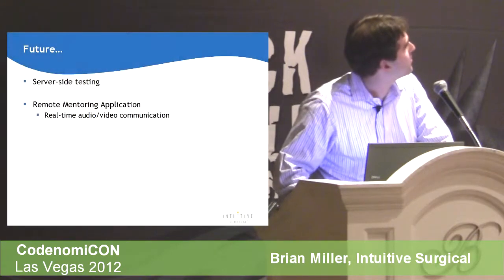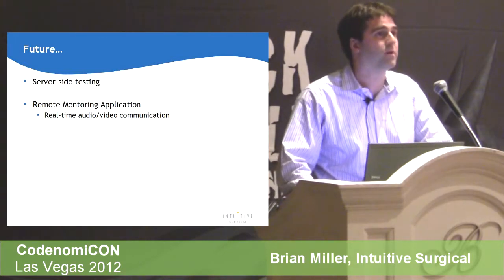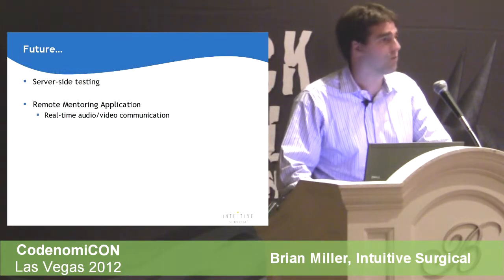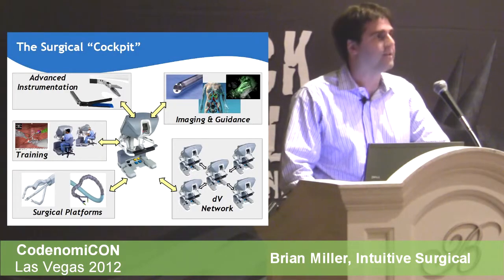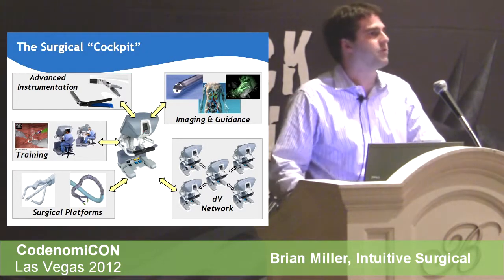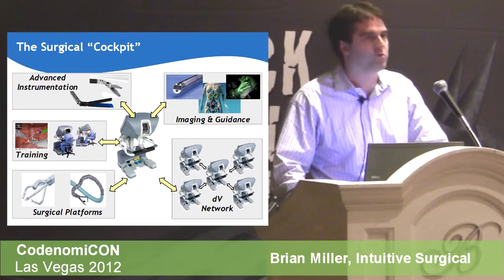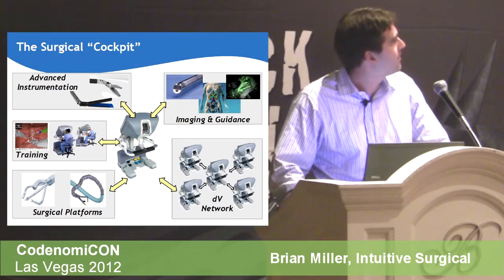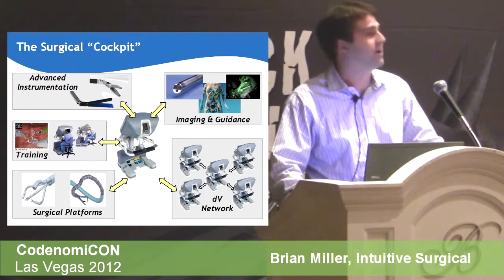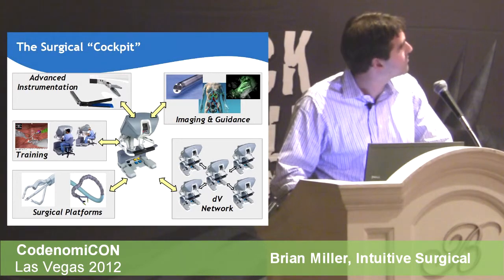As we look into the future of what we'll be doing from the robotic standpoint to help surgical techniques out there, the one that's most relevant to this group is probably the bottom right hand corner. The idea is that with these systems we can network them as we've done, communicating back to a central server, but the idea of having one surgeon on one console helping to train another surgeon on another console is compelling. Being able to have the systems communicate as a mesh as opposed to client server based is compelling from an application perspective.